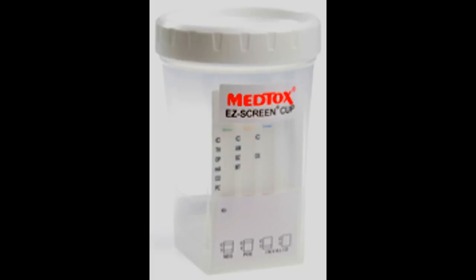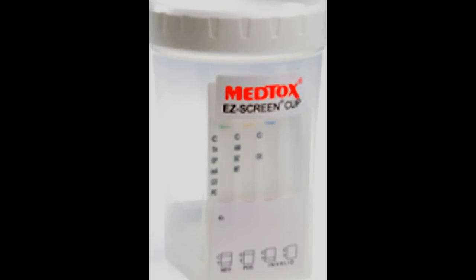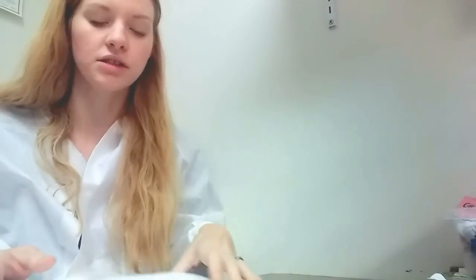I don't have what the actual migration looks like on the drug screen. I'll put up a picture here, but on the side of the cup, if there's a line there, then that's negative. The absence of the line is actually a positive test or non-negative. And so with that, it's a presumptive positive, and it will get sent off to the toxicologist, and they'll run their, what's it called, LC-MS, liquid chromatography mass spec, yeah. And that's like the gold standard for drug screening, not just the drug screen.